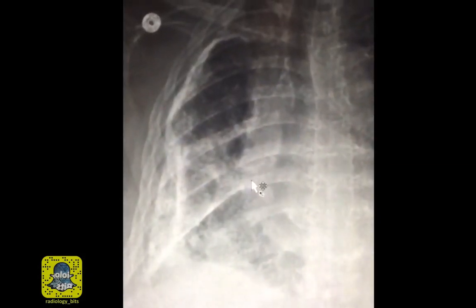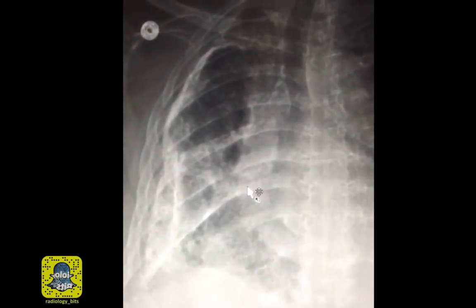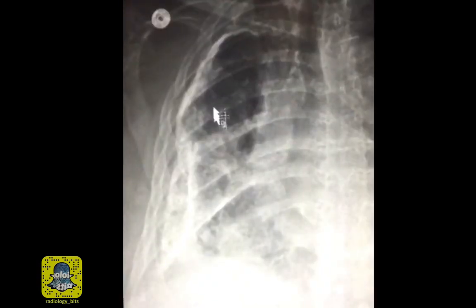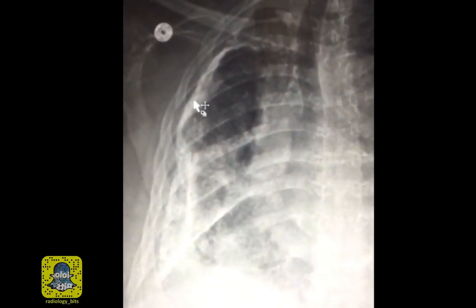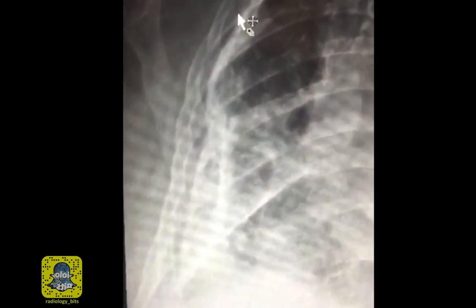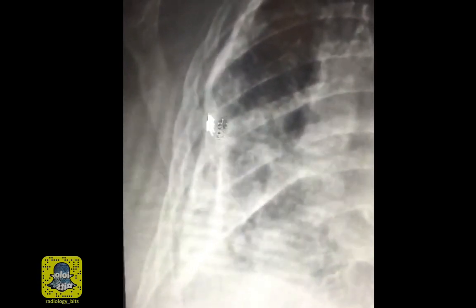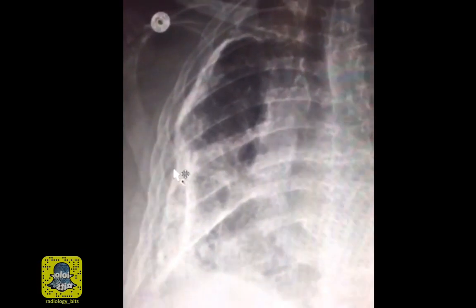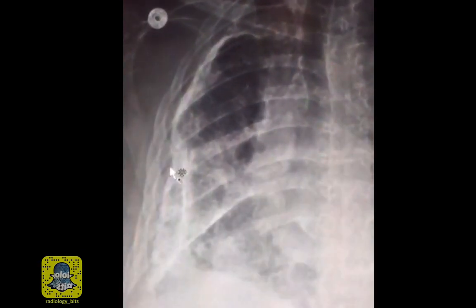So we learned from this case an entity called calcific fibrothorax, which may be caused by previous insults — commonly TB is the culprit. The classic appearance is thick pleural calcifications with volume loss. Another neat fact is that there is something called subpleural fat that's usually thin and may be hypertrophied with volume loss. And very importantly, do not confuse this appearance with a pneumothorax.